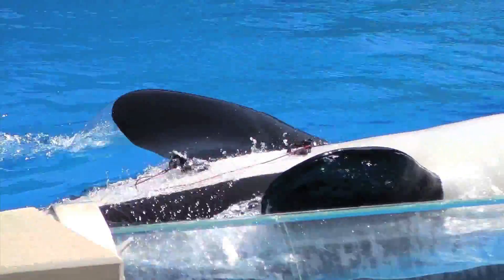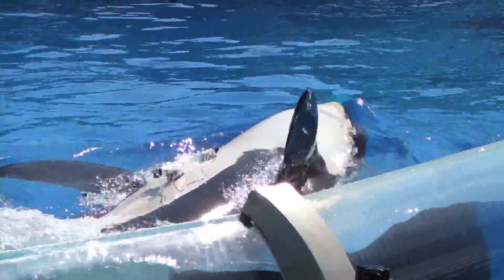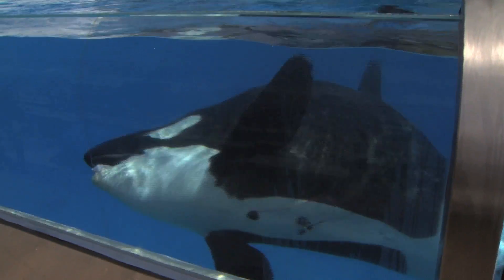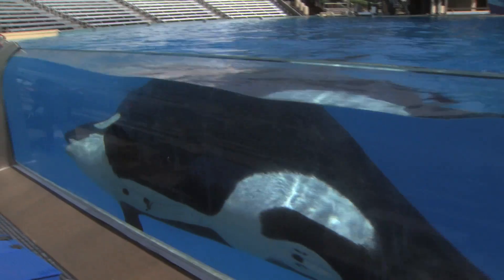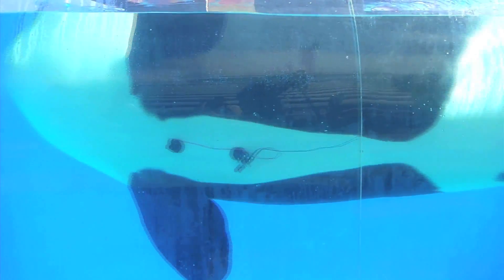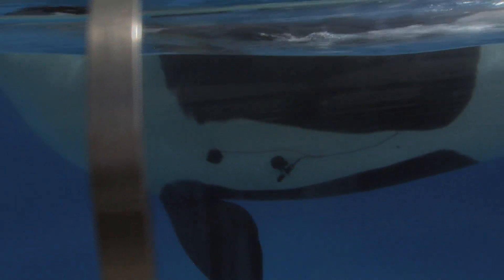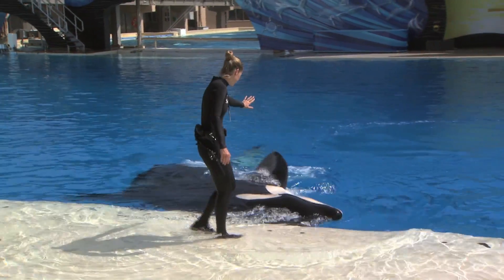The second area where this can be used — the direction that we're going in — is to try to evaluate what is causing stress and other problems in these whales when they encounter different stress exposures in the wild. These include exposure to sound and boat traffic. By monitoring the electrocardiogram and the heart rate of whales in normal activities versus those that are fleeing ship noise, we can evaluate what the physiological and stress responses are to help us mitigate the problem.